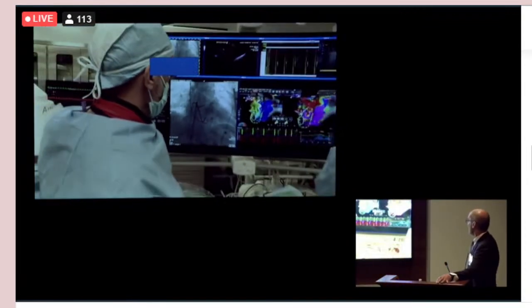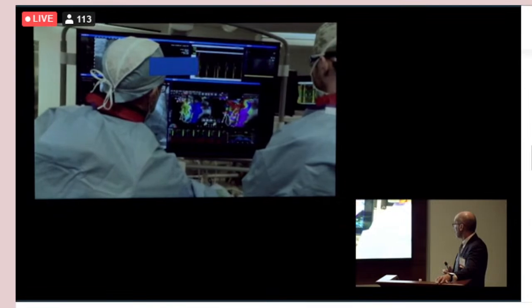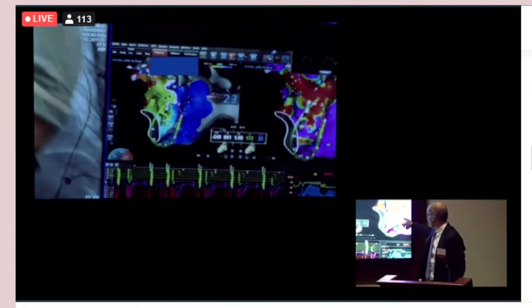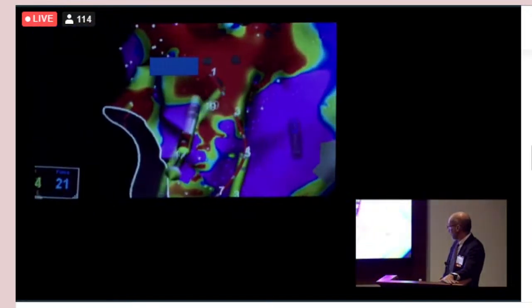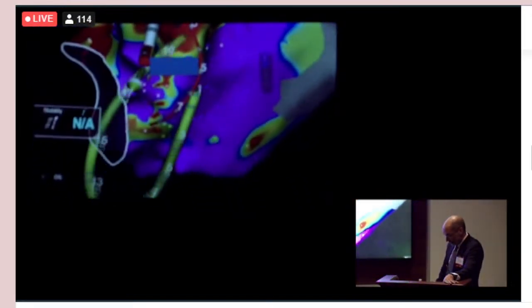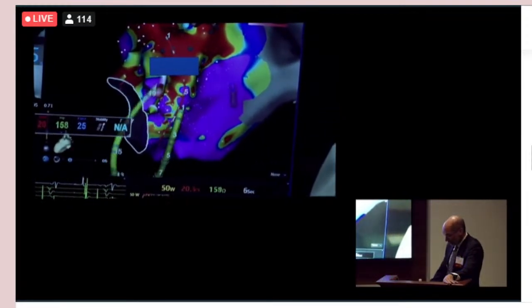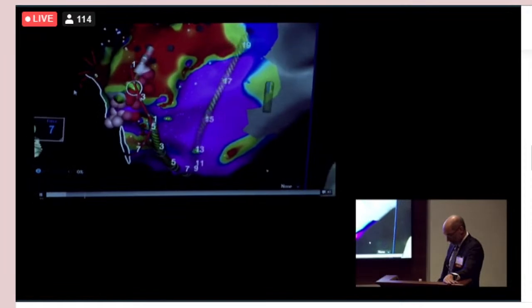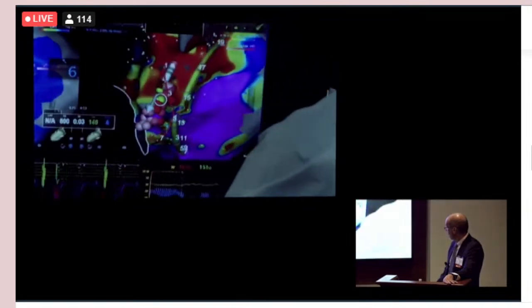So what I'm doing here is I'm putting the ablation catheter in the annular aspect of the alcohol-induced lesion, which is not ablated by alcohol. And you see the ablation lesion. I'm putting my catheter right annular to it, and we will start ablating at that point. And I like to do it while pacing so that we can track when the perimitral block is achieved. I think this is it. We're burning, and at some point I'll show you the signals when the activation patterns change.